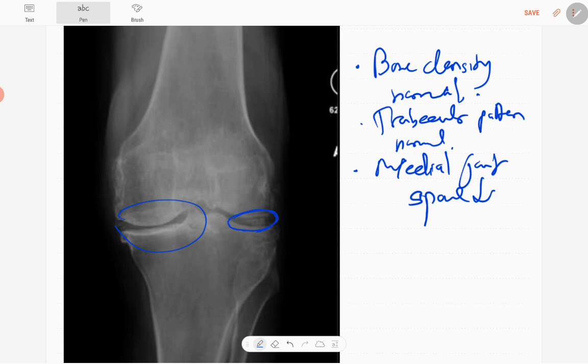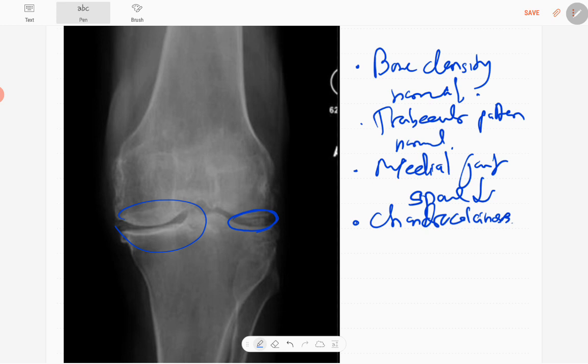There are calcifications - high density areas in relation to the lateral meniscus. Chondrocalcinosis is there. High density area in the region of lateral meniscus and also in the medial meniscus you can see.